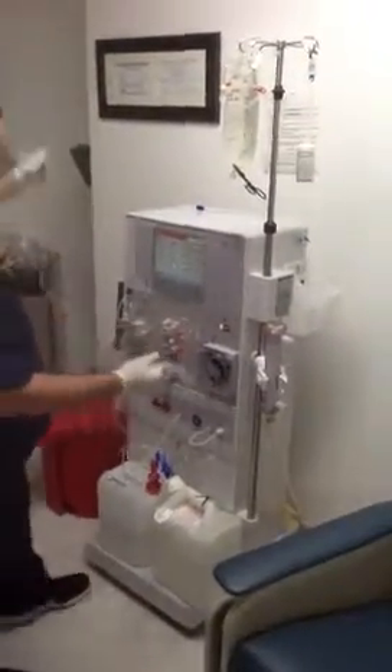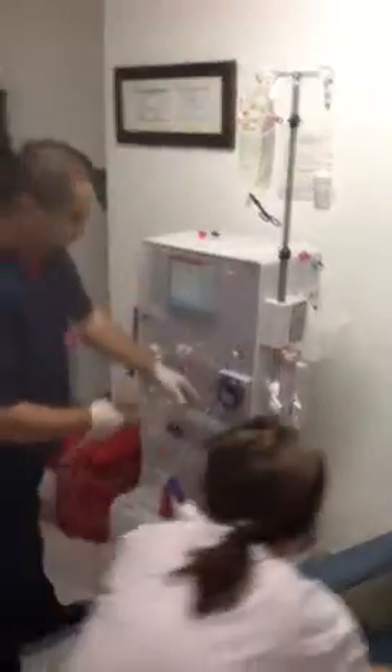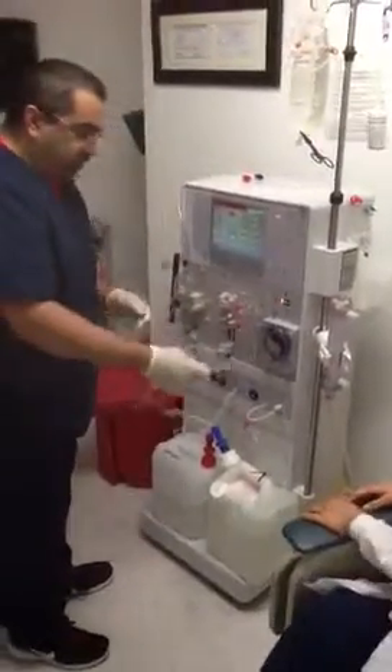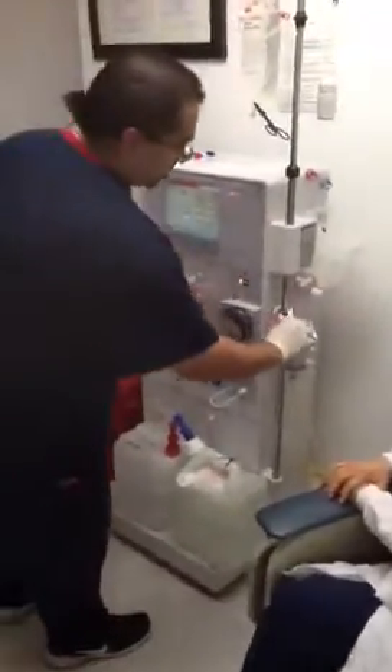The arterial bloodline goes to the patient, right next to the venous bloodline to the patient — those are the ones with the big clamps. Your blood pump segment is this thick tubing here, and this is your arterial bloodline to the dialyser.